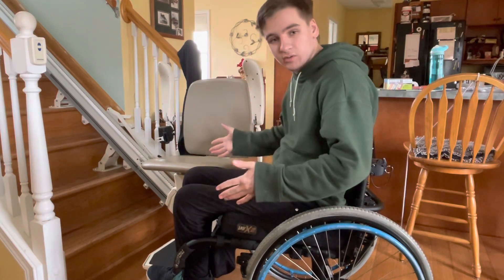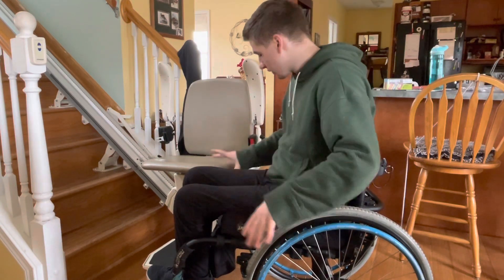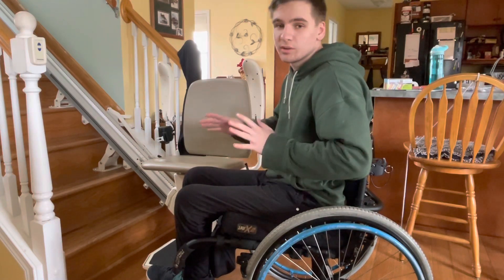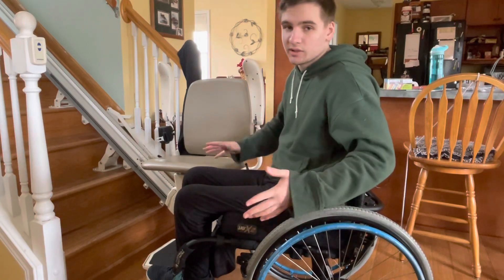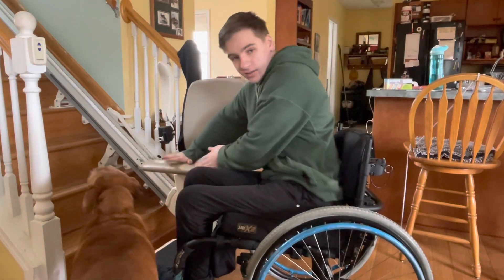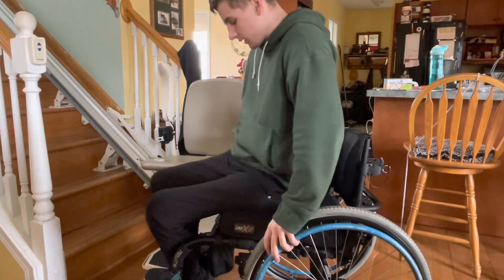So how I would go about transferring into this: first step, you're going to want to get to the corner of your chair that's closest. I have the corners of where I'm transferring and where my chair is basically touching, because what you want to do — it's not like a sliding motion, it's more of a rotation. It's like you're rotating from your chair and you rotate onto the other surface with your butt.